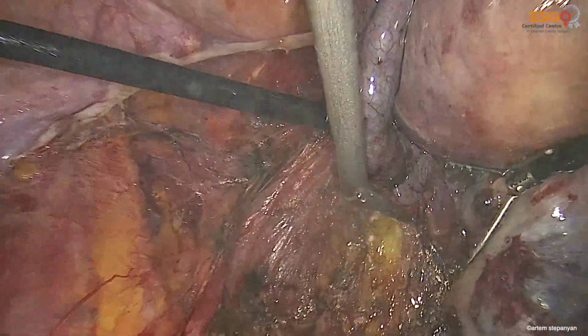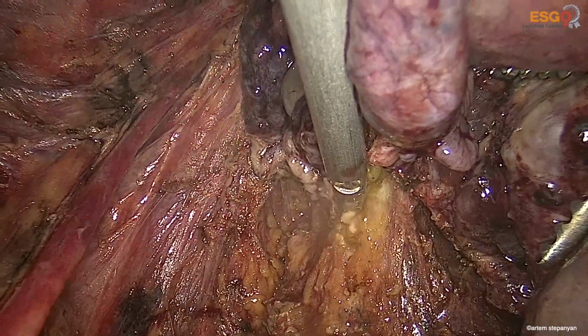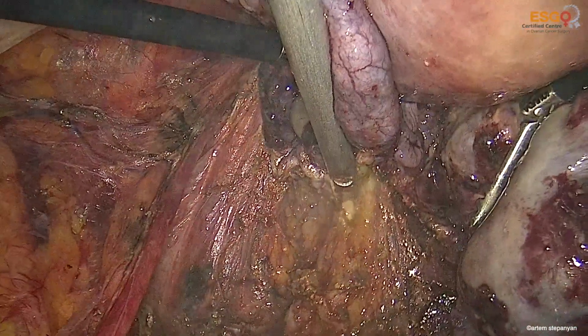Keeping the branches of the right inferior hypogastric plexus under visual control.